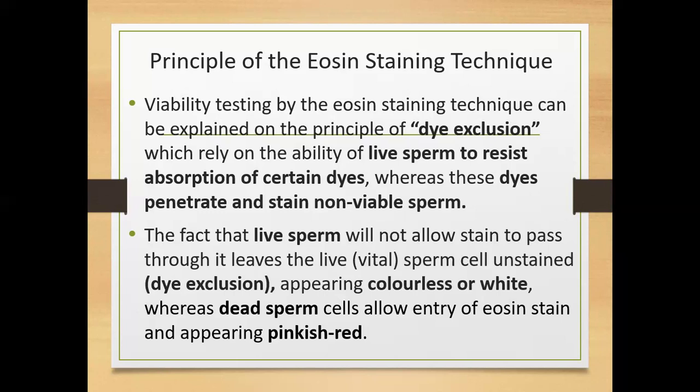But is it going to stain the dead ones pink? Yes, the dead ones. But that wasn't the question. I'm saying the live cells, which you saw as dead, but the cell membrane is intact.